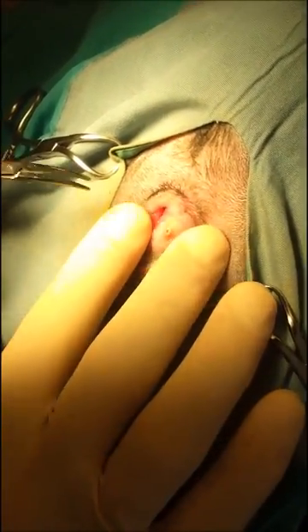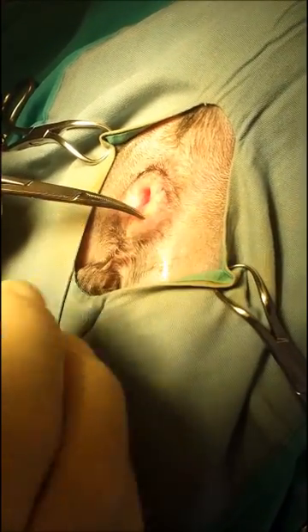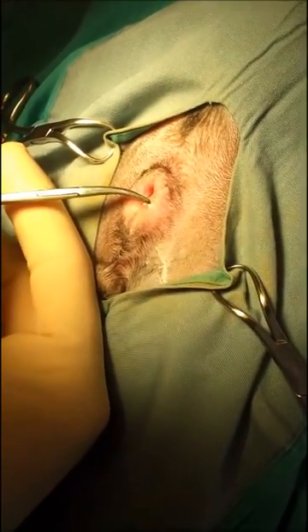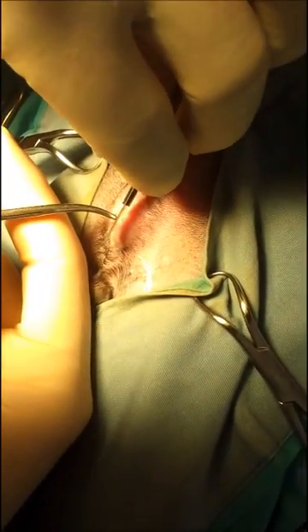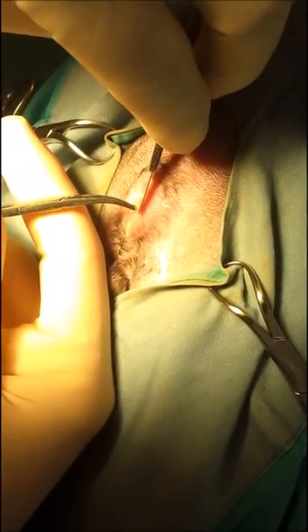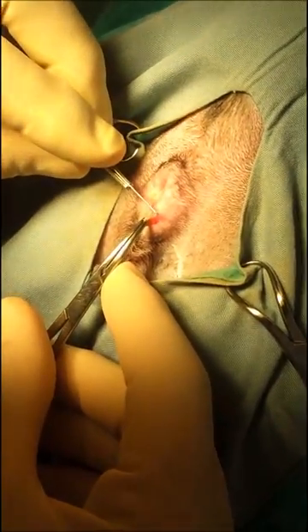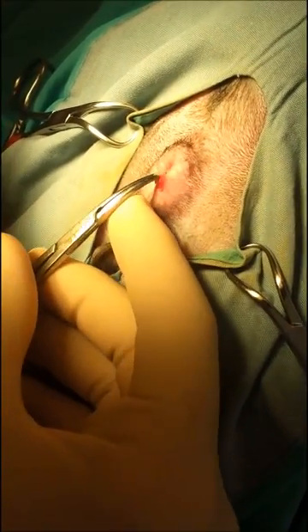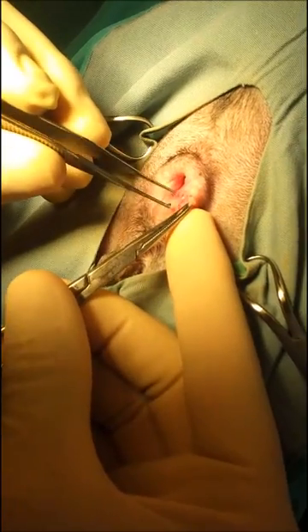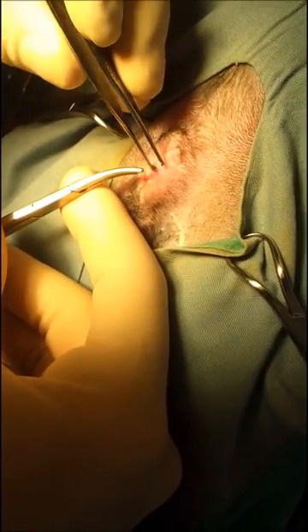The procedure is technically quite difficult, but easy to explain. The first thing you do is grab and pinch the duct with a forcep and make a circumferential excision of just the skin, using very gentle pressure. You want to include the whole duct. You don't have to make a large incision — once you've made the incision, the tissue will stretch and be much wider. So you can have a small incision that stretches, and when you sew it back together it becomes small again. Your initial incision can be about half the size that you think.